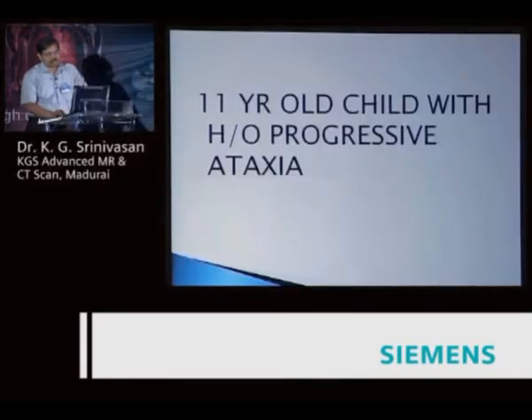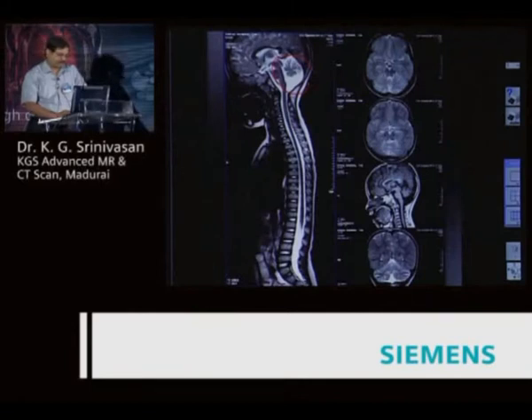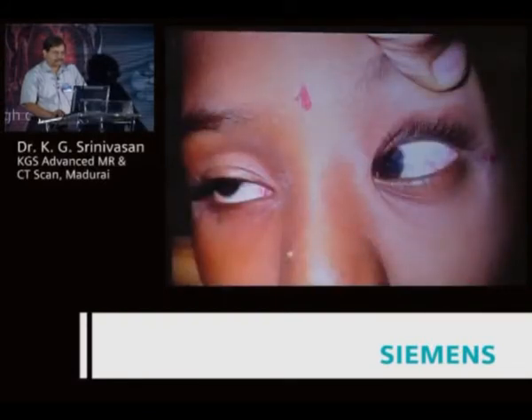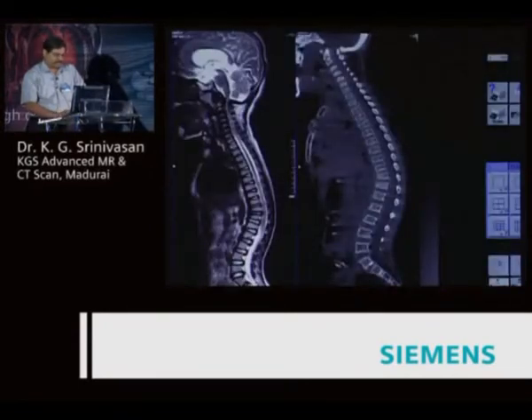Eleven-year-old child with progressive ataxia. You can see significant cerebellar shrinkage with prominent cerebellar hemispheric and vermian sulci, mild atrophy of the spinal cord with roomy CSF subarachnoid spaces — the classical appearance of ataxia telangiectasia.